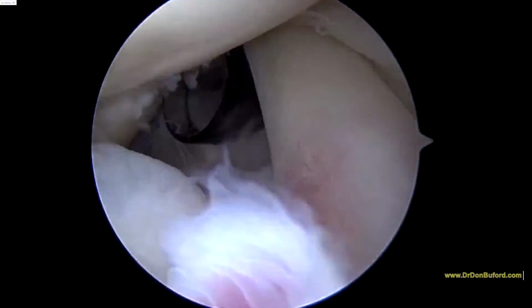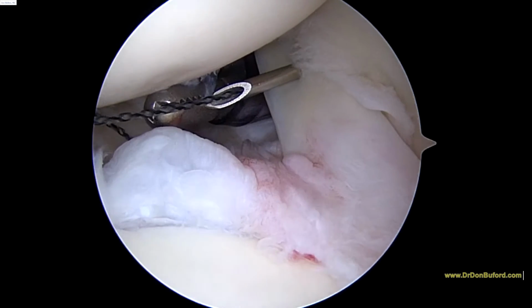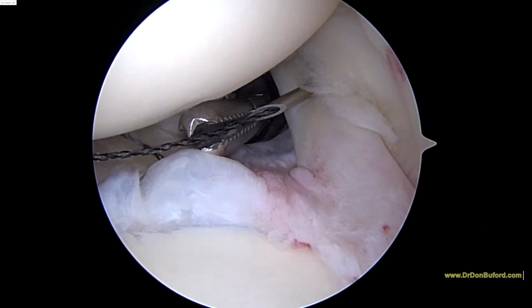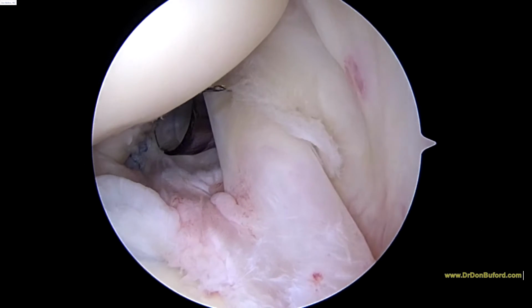And the way that we're going to deal with that is we're going to take a spinal needle and pass it through the tendon in just a minute. Okay, so there's our needle coming through the tendon. We're using that same shuttle. We'll back the needle out. And then here we'll go ahead and load this with a free stitch. There's no anchor attached to this one.